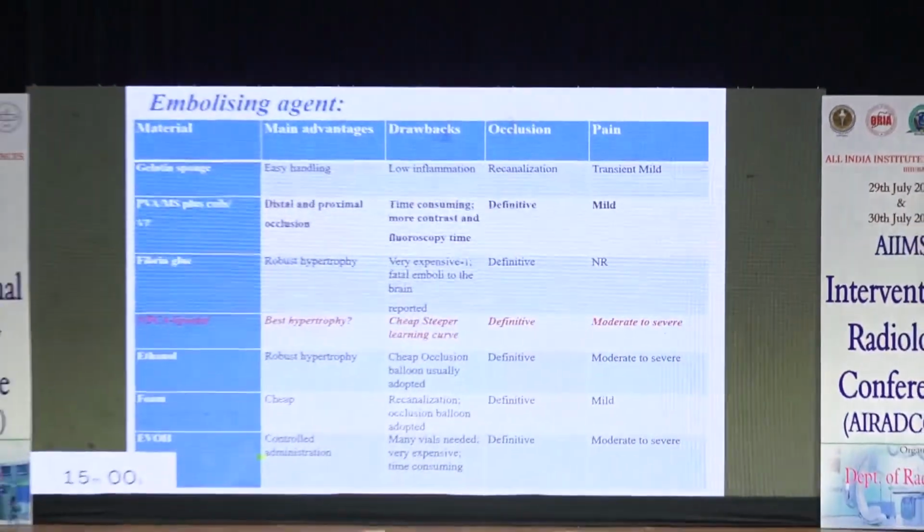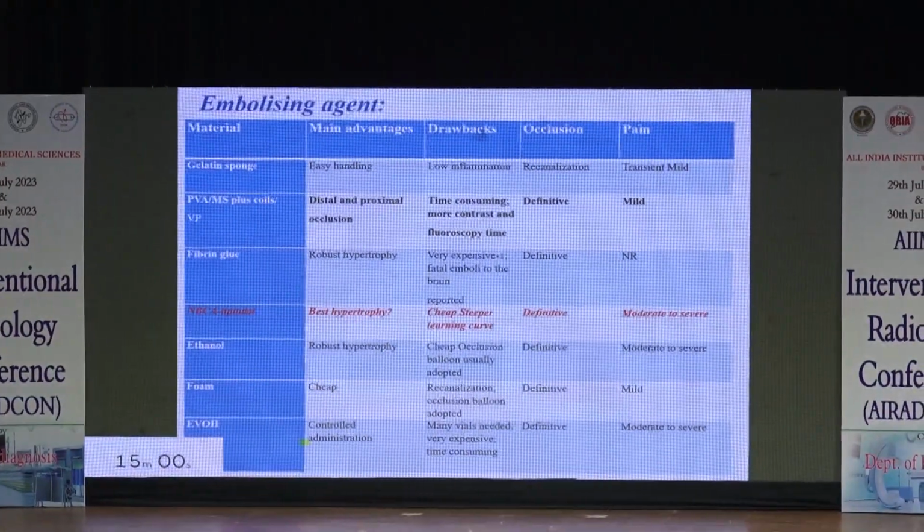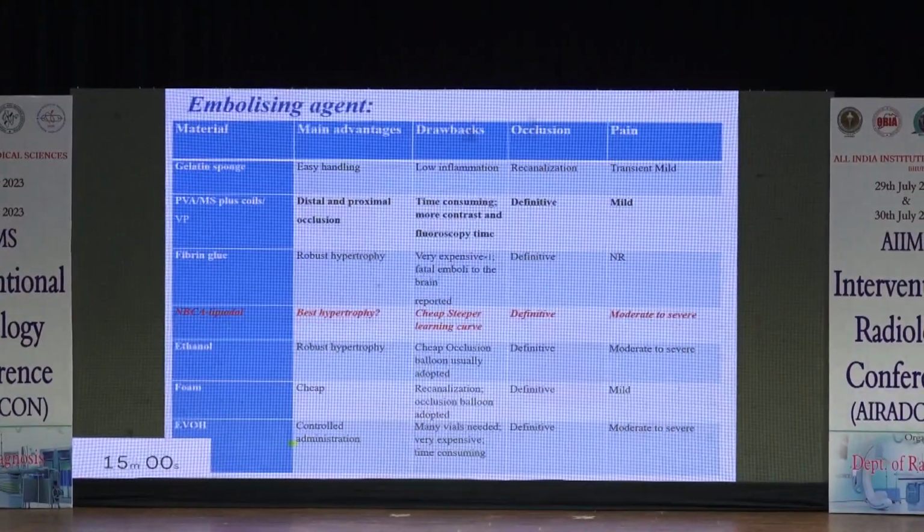Okay, sir. Thank you, sir. Sir, you also take us through the embolizing agents. There are several embolizing agents. People have used different embolizing agents for embolizing the portal vein. We have shown you glue for embolization. So please take us through the various agents and what the advantages are.